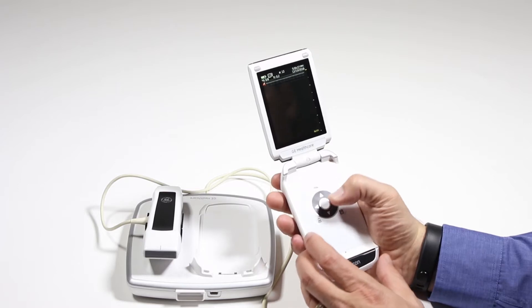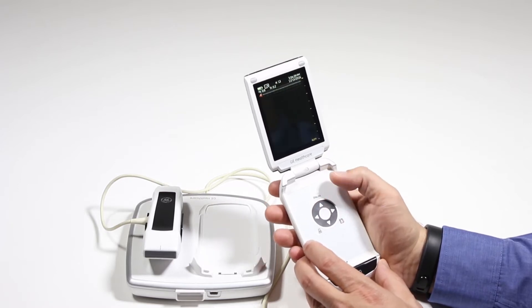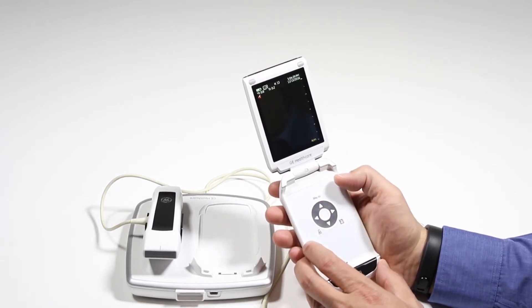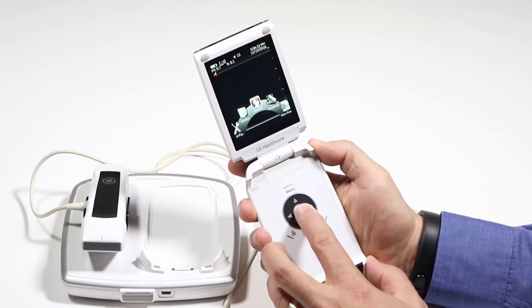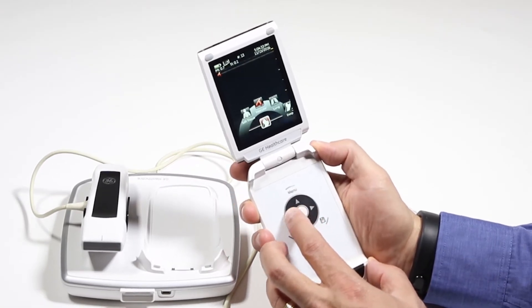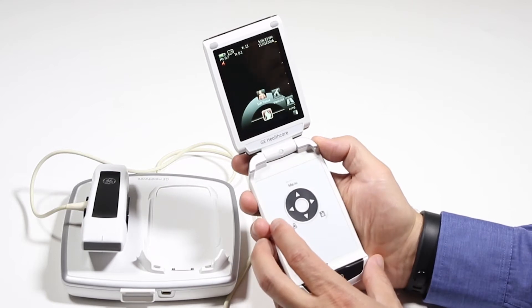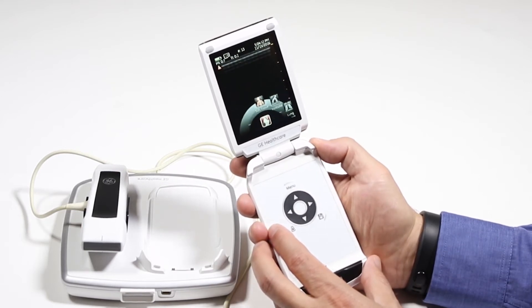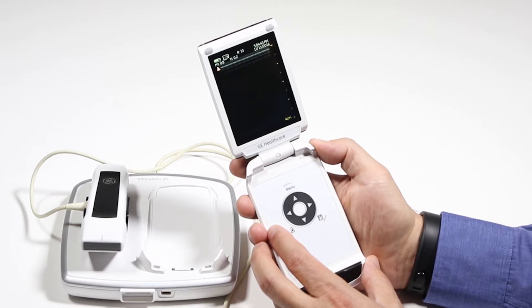Now that we have those basics down, let's get into some of the interesting things about scanning. I'm going to select my new preset to get started, pick a different one, just soft tissue here, and I'm ready to start scanning.